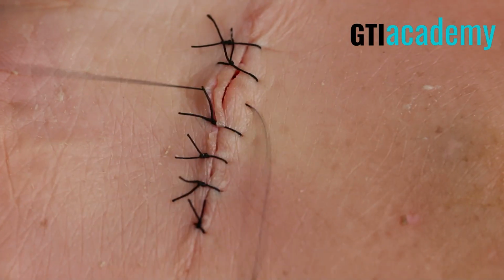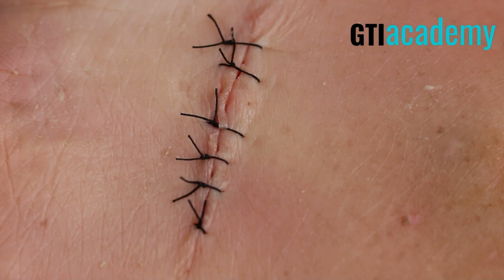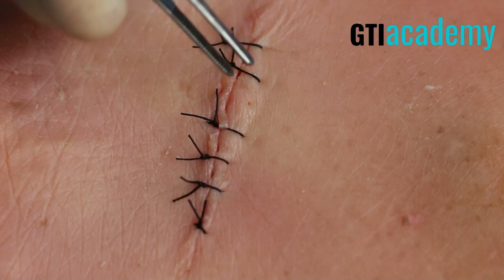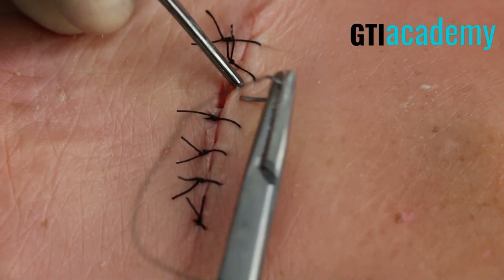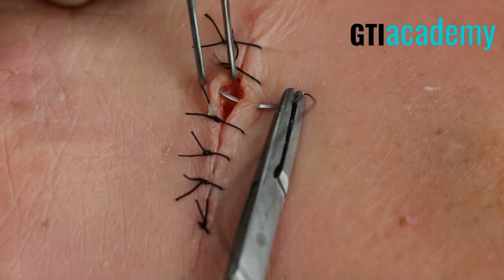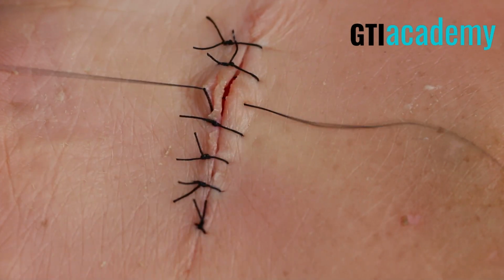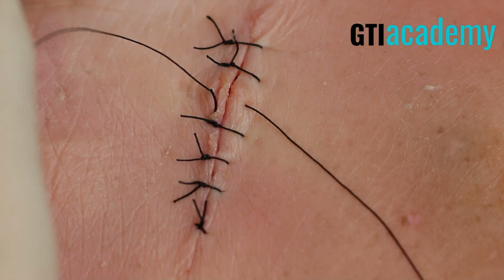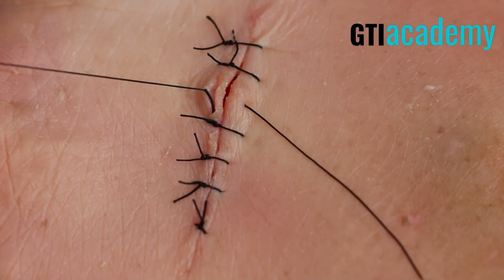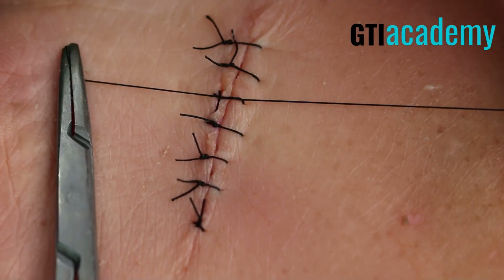Excellent. We'll take this one right here. Just pull that one through. Look, this will happen in real life as well too. So don't give up. Don't take them out. You can simply re-enter that same area, which is what I'm going to do right now. There you go. And drive through. And this one's going to close really, really well.